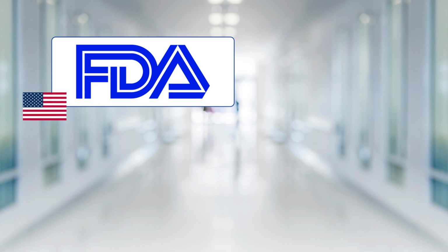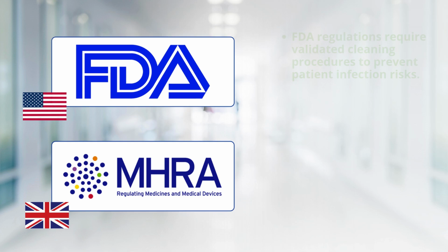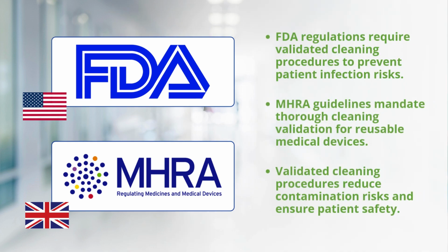Regulatory agencies, such as the FDA in the United States and the MHRA in the United Kingdom, mandate strict cleaning validation protocols. Compliance with these standards is not only a legal obligation, but also a commitment to patient safety.